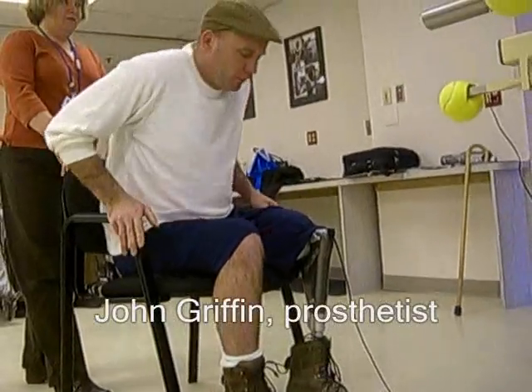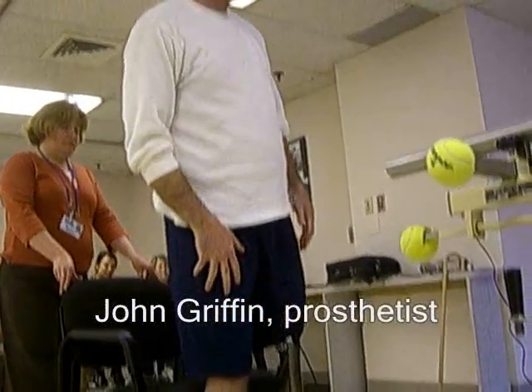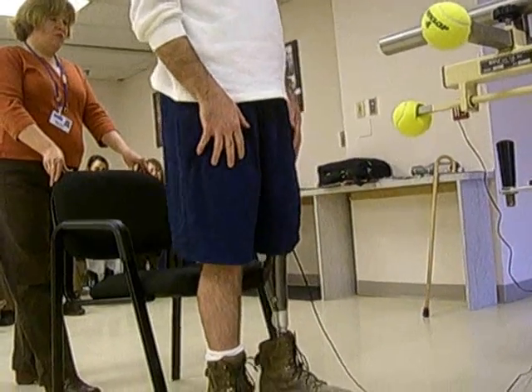Now, if we wanted to go change that, we could change it. Make it a little stiffer, so I get on a little slower.